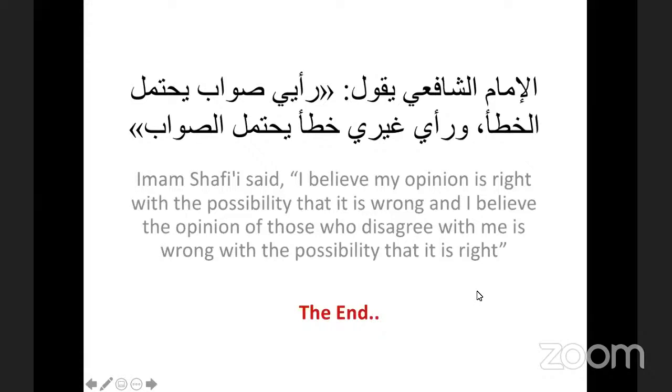Someone is asking, when we want to issue an initial report for a peripheral blood smear, especially for mantle cell or T-lymphoblastic lymphoma leukemia, do we write the percentage of the cells, or do we say atypical lymphocytes in the peripheral blood smear before getting the result of the bone marrow? It depends on the institute that you are working in. I recommend that you always follow the protocol, the guidelines, the SOPs in your hospital.